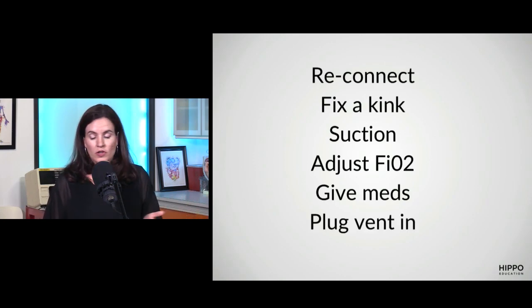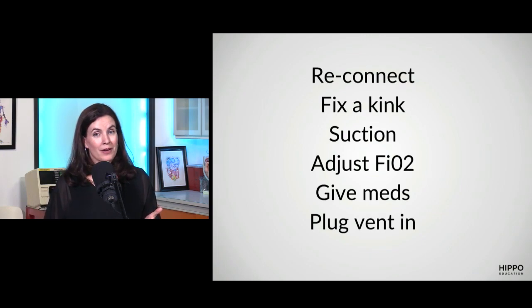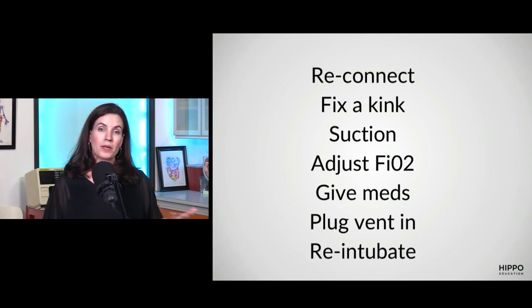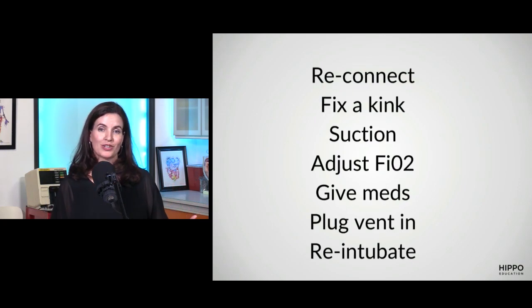Sometimes the patients just come back from CAT scan and nobody plugged the vent back in, and it's alarming because it's low battery, and then you can do the hero move of plugging it back in. Or maybe they've self-extubated and they need you to put the tube back in. What I'm trying to express here is that there are all sorts of easy wins that you can have at the bedside without knowing anything about the vent alarm. Just having you in the room is value add for managing this patient in a whole variety of situations.